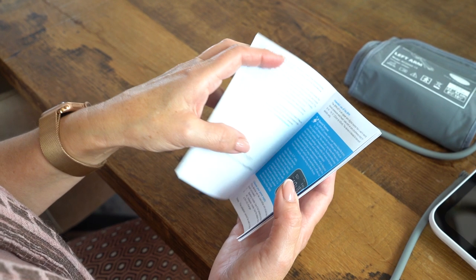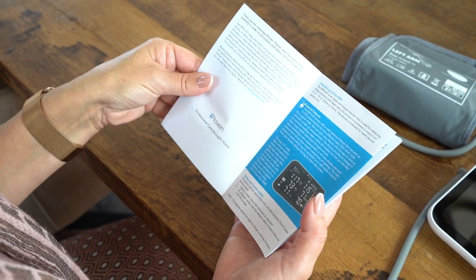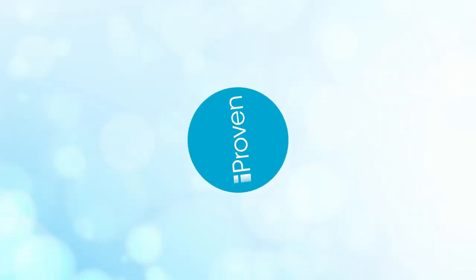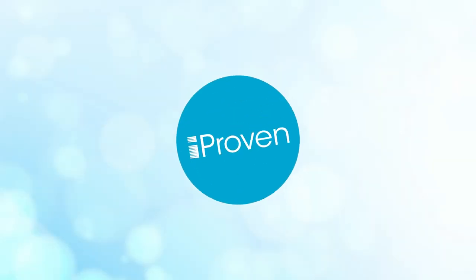If you have any further questions on how to ensure accurate measurements, please refer to the instruction manual. iProven — professional care brought home.